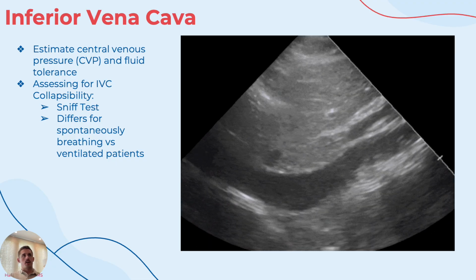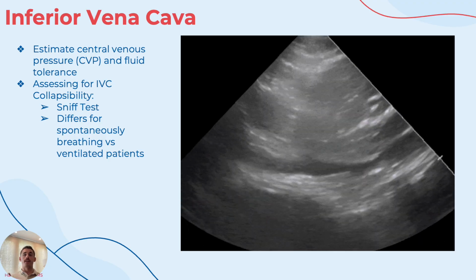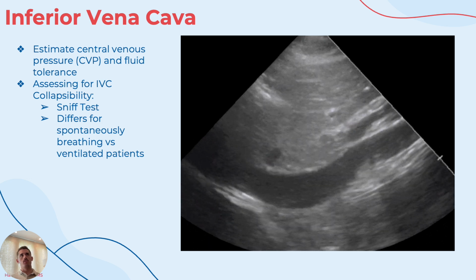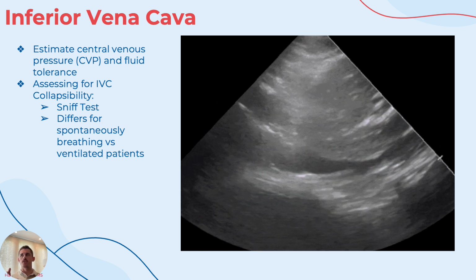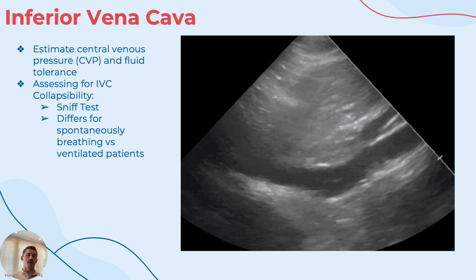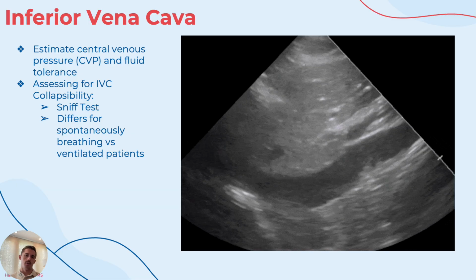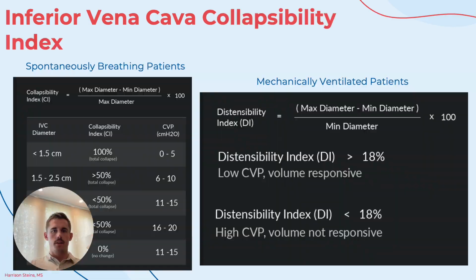I see a lot of people starting to learn about IVC and looking at the aorta. With such big vessels, you can't necessarily rely on the compressibility. You also don't know if your image is getting both of these or if you just lost the IVC and you're replacing that in your head with the aorta. So I rely on dumping into the right atrium for the inferior vena cava identification.